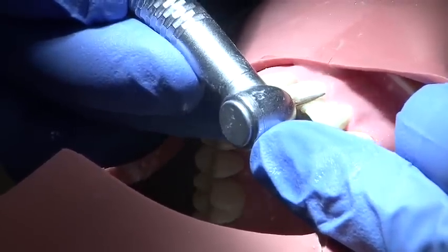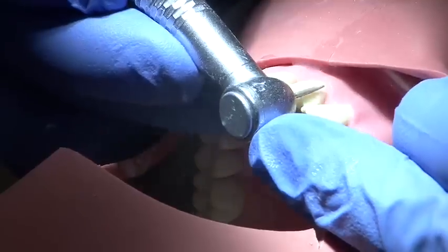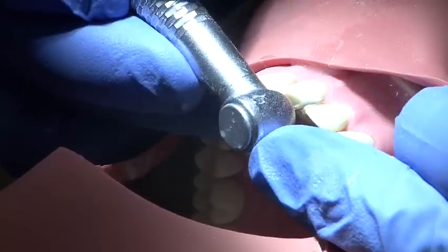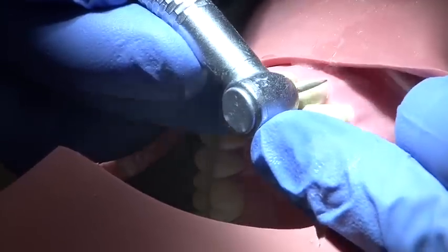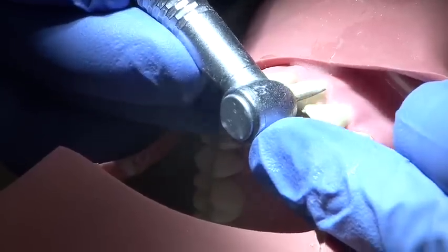Interproximal reduction is carried out using a fine pointed medium grit burr. A smooth action is employed and the burr hand is supported at all times to prevent slippage and damage to the adjacent tooth.